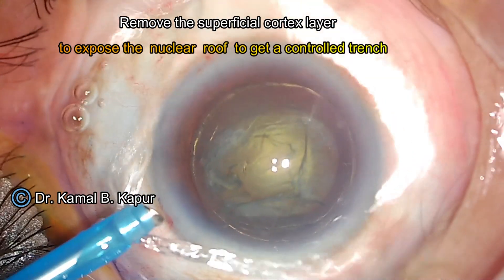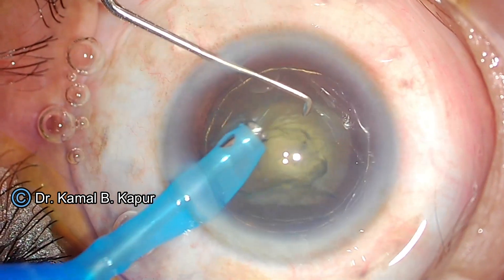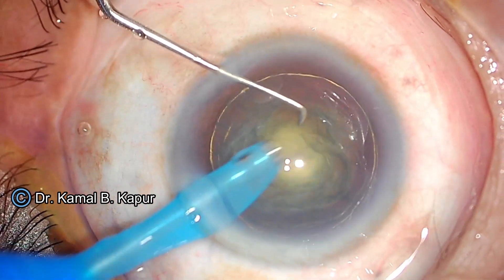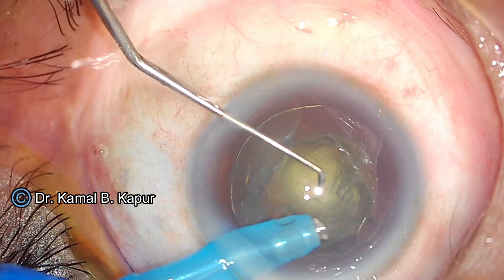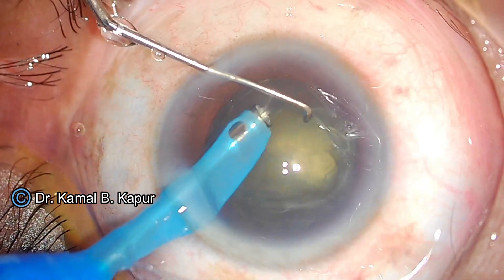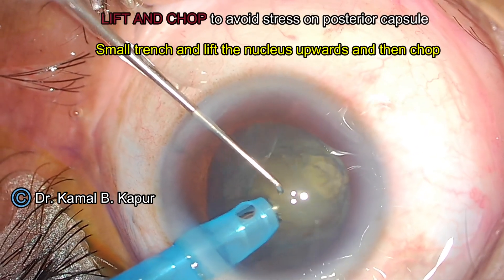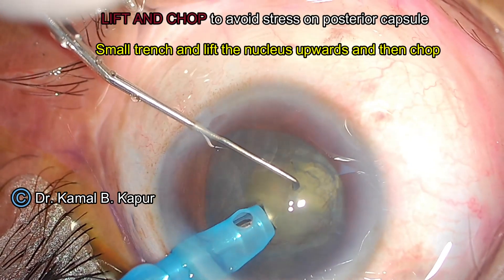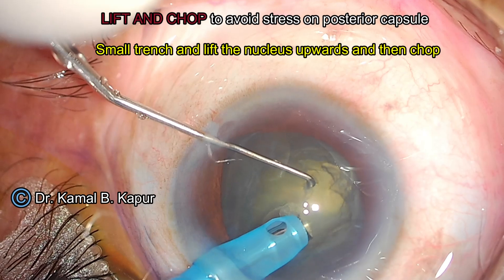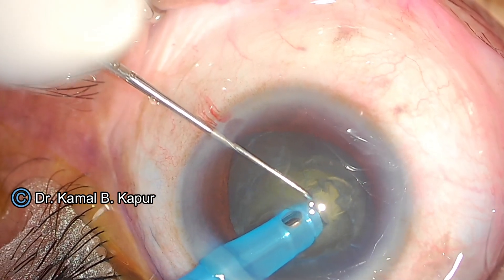We create a lot of rings by doing hydro delineation. We do a moderate vacuum and a moderate phaco of around 30 phaco power. We ensure that the complete cortical plate over the nucleus has been removed. While doing this, we ensure that we do not rotate the nucleus or the cortical plate, because this itself will disturb the posterior polar and cause further breakdown of the posterior polar.